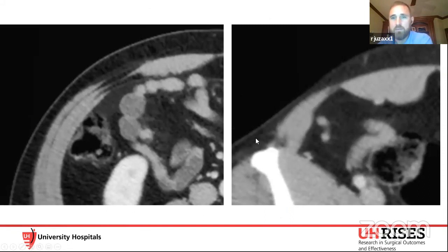Here we see blown up images on the same guy, same CAT scan. We see those fibers going anterior, splitting, going anterior and posterior, and then going completely anterior: external, internal, transversus. In the lower half of the abdomen, here's the ASIS, the external, internal, and transversus all migrating anteriorly to the anterior rectus fascia. We're saved by the peritoneum and space of Retzius fat that allows us to dissect down below this level. Otherwise, we'd have a tough time reconstructing the posterior layer down low in the pelvis.